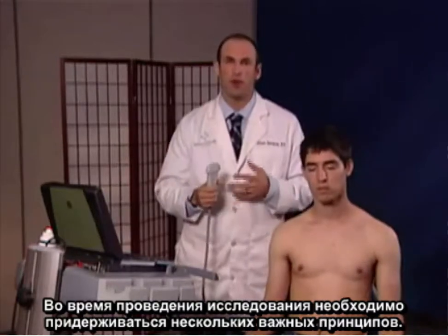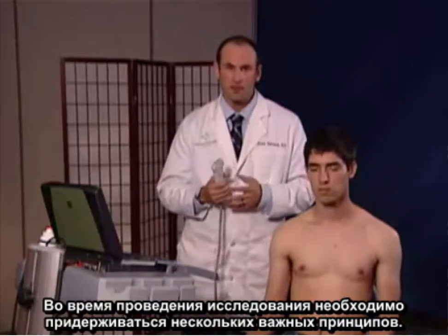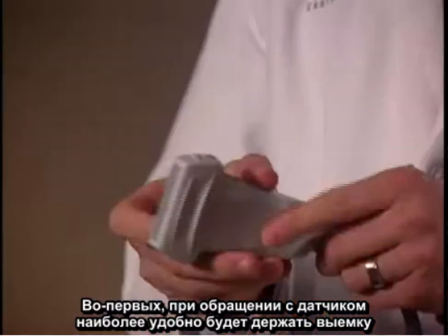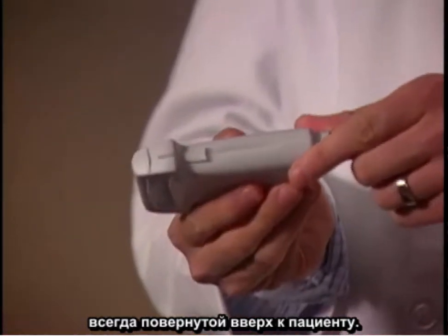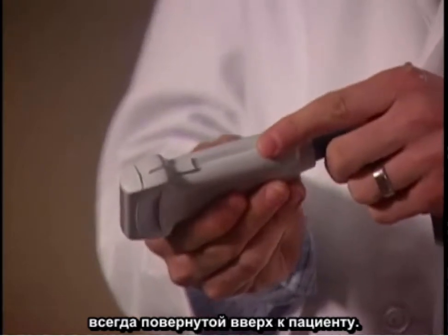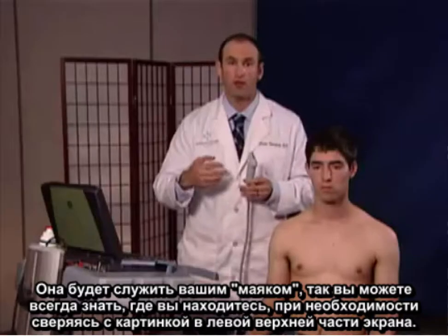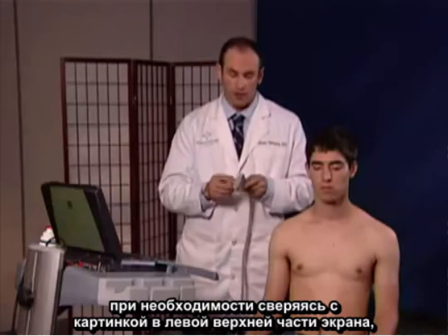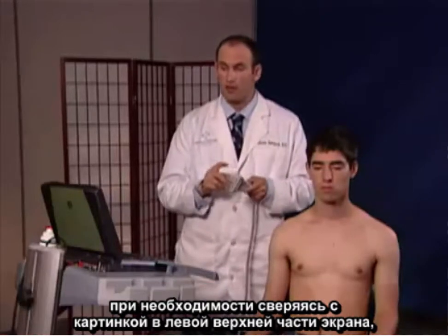In examining the shoulder, there are some important principles to follow. When holding the transducer, it's easiest to have the notch always facing upwards or cephalad on the patient. That will always be your lighthouse of exactly where you are. I always keep the notch upward and look at the upper left-hand corner of the screen to make sure I know exactly where I am.